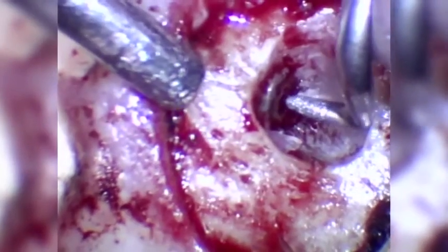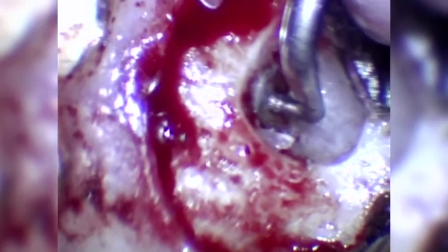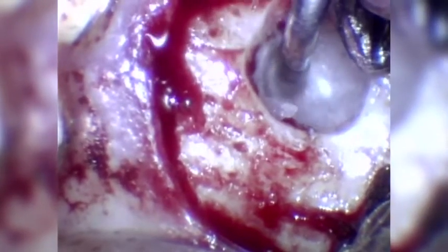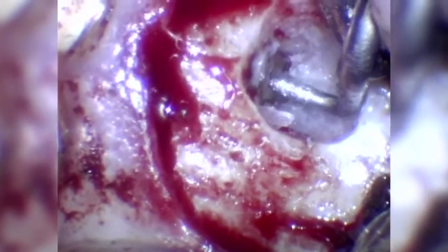After location of the canal entrance at the anatomical apex, the retrograde cavity is prepared with a filing action. During preparation, the retro tips should only be used with light pressure as this produces the optimal cutting action. The tip is routinely checked to ensure that the diamond coating is not clogged with debris as this may affect the efficiency of the cutting action.